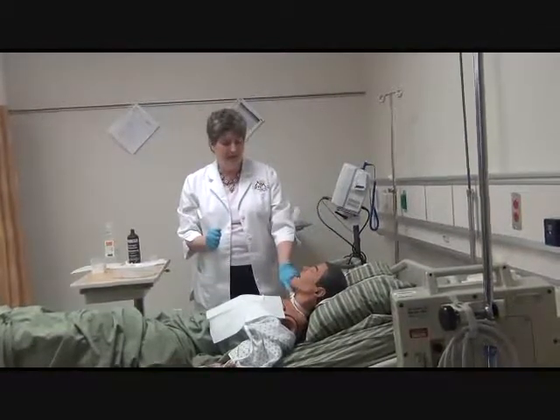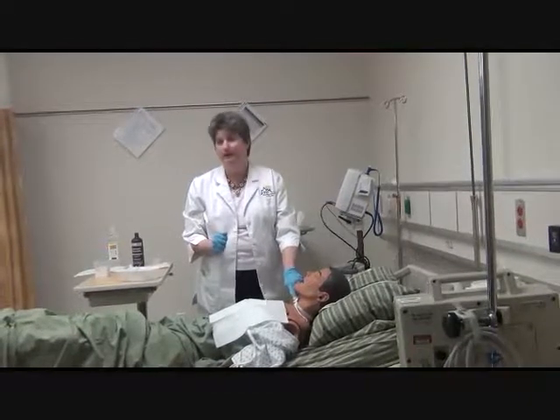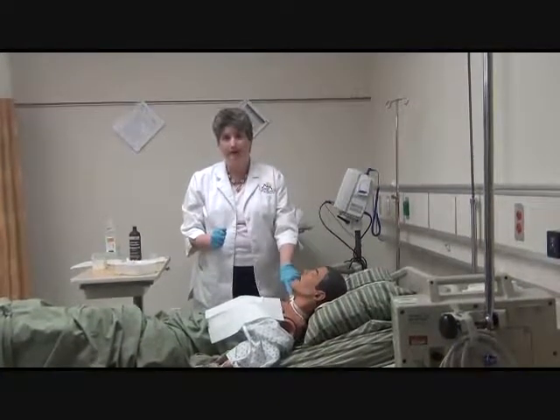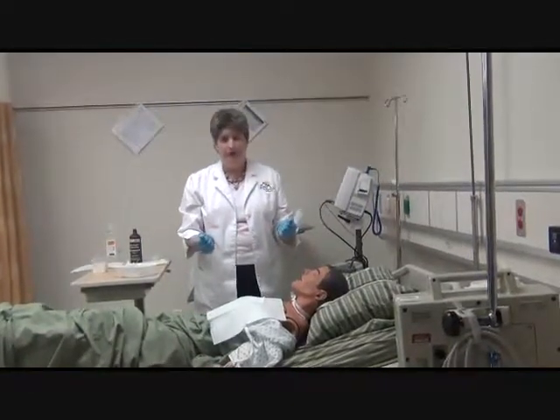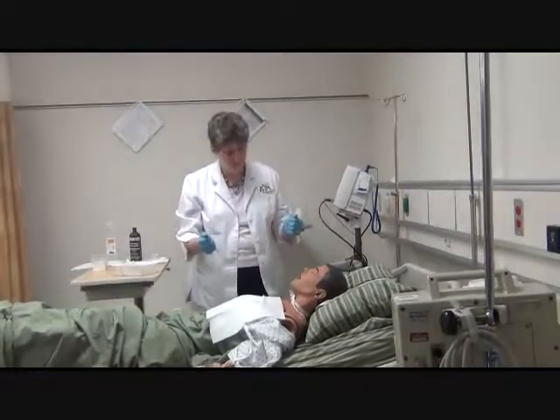My understanding now is that some of the trachs come with the inner cannula as a disposable piece, and you won't have to do this procedure. You may just have to make sure that the skincare is done, this gets thrown away, and you just put in a new one. But in the home situation, usually they are a reusable supply.